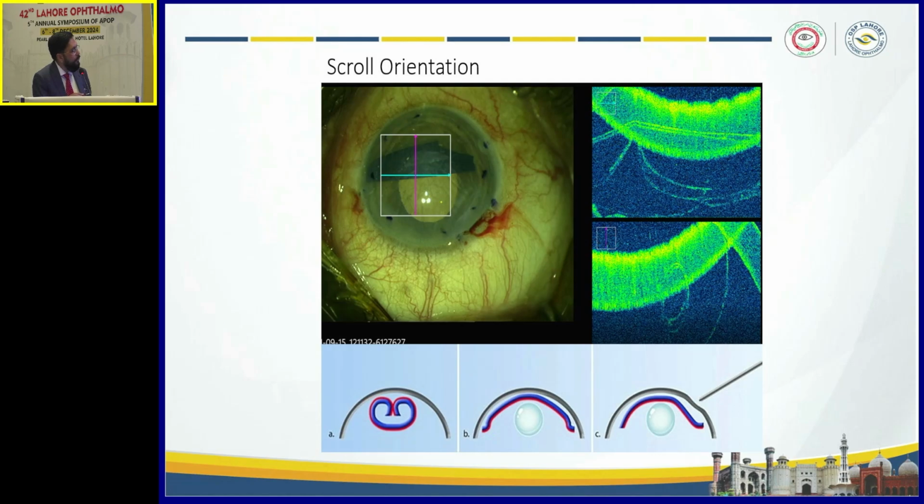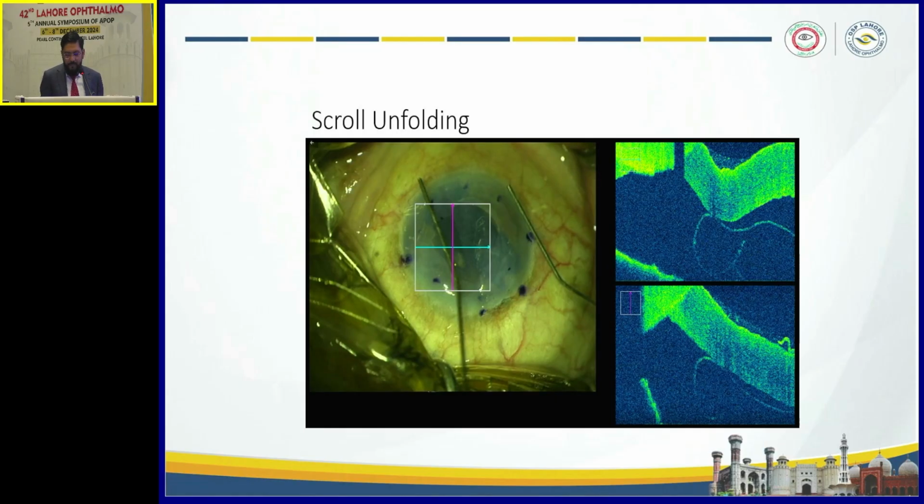This arrow is visible over here. So if we look carefully, this is folding like this. So if we unfold it here, we'll be in the right orientation as mentioned here. So if we unfold, this red is actually the endothelium. So endothelium is going to be at the bottom of the graft, which is the right orientation. You can see the cut of the arrowhead over here as well. So I usually cut an arrowhead instead of marking S. Again, is this orientation right?